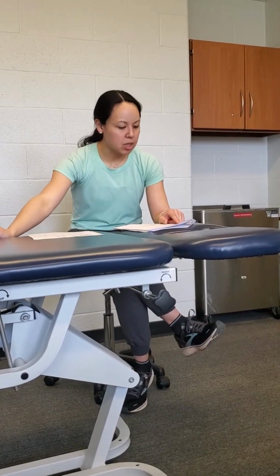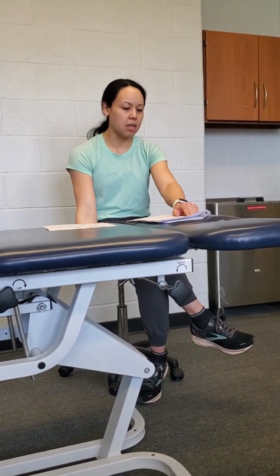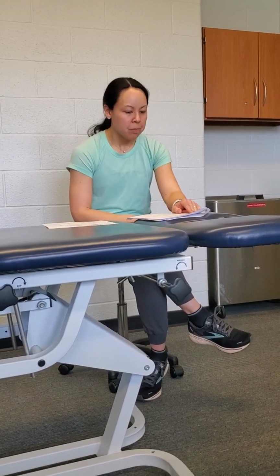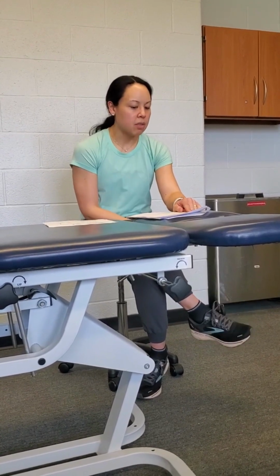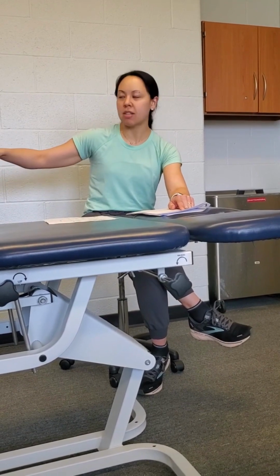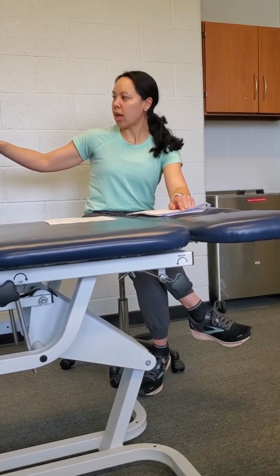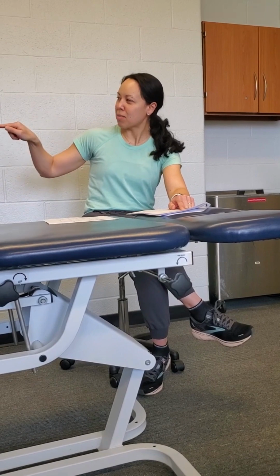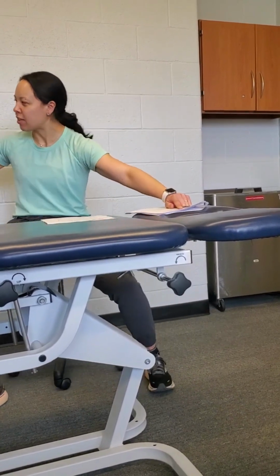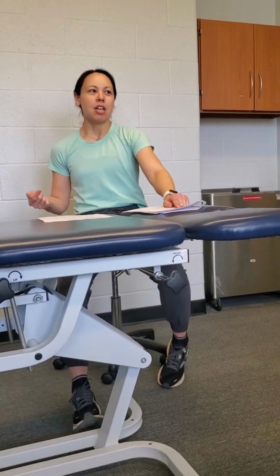So the ratio is typically 1-to-1. So you want that 2-second concentric phase, 2-second eccentric phase. So you don't have to worry about one being longer than the other. Always have 30 seconds of rest between sets, and the machine will tell you, because it'll tell you the work, and then it'll say rest, and then you hit the rest button, which gets a little annoying because you actually have to physically hit the rest button each time.